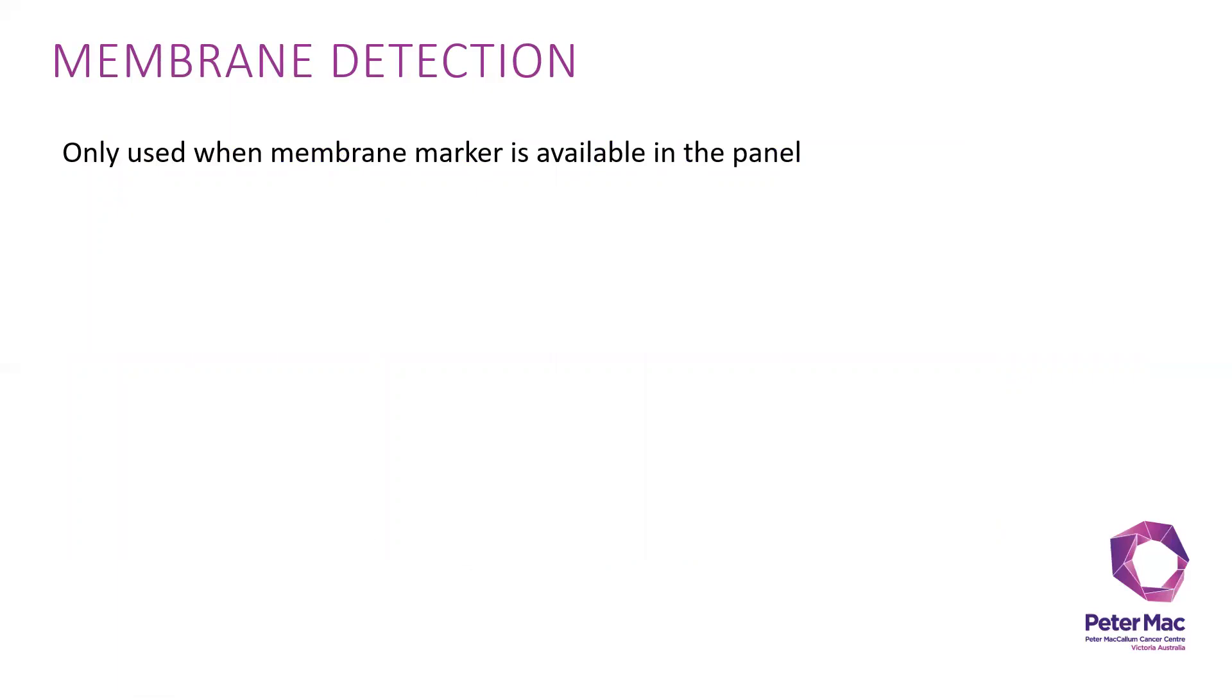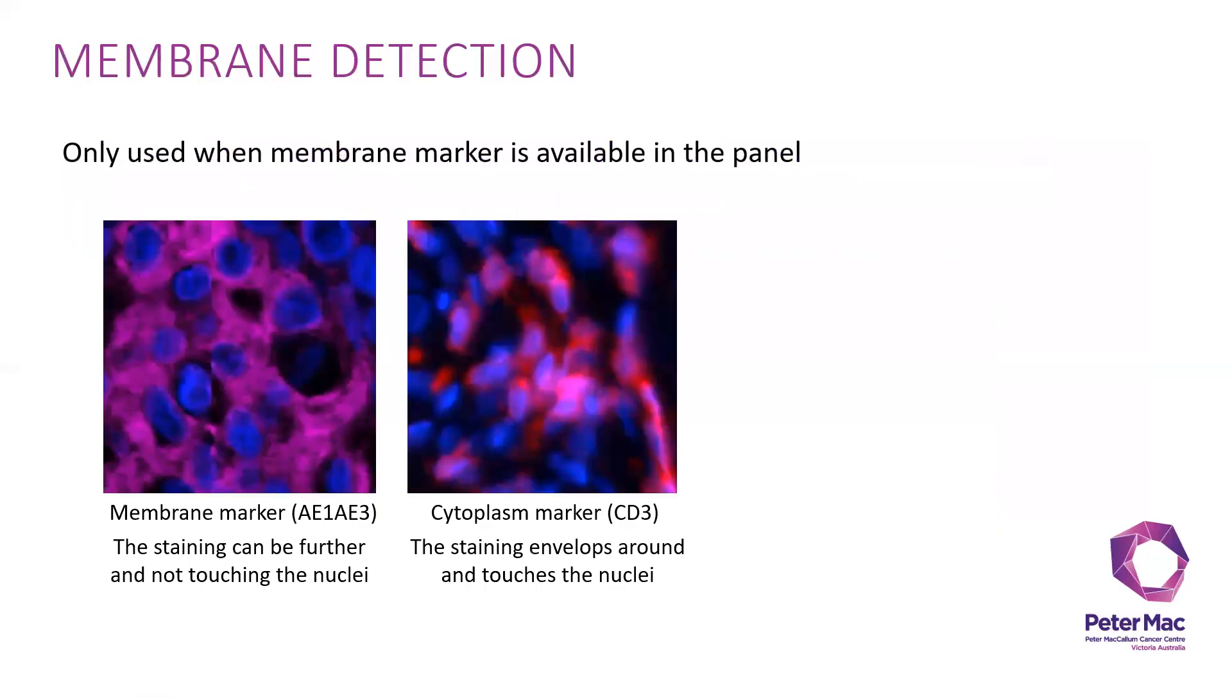Then membrane detection. You only use this when a membrane marker is available in the panel. In HALO, it's a bit different. Membrane marker in here will refer to the staining that is further and not touching the nuclei, as you can see in this particular cell on A1A3 marker. For the cytoplasmic marker, for example CD3, it is a membrane marker, but because the staining envelopes around and touches the nuclei, it is classified as a cytoplasmic marker in HALO.